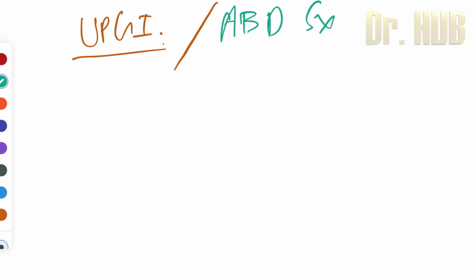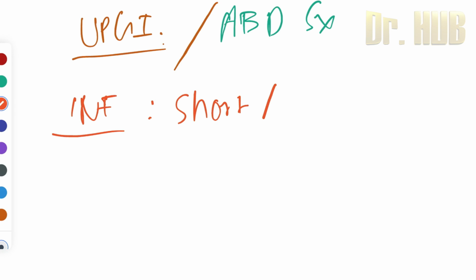The infant feeding tube is shorter than the Ryles tube. So in case of infant, it is short. Next is, it has similar indications to the Ryles tube in case of the infants and children.